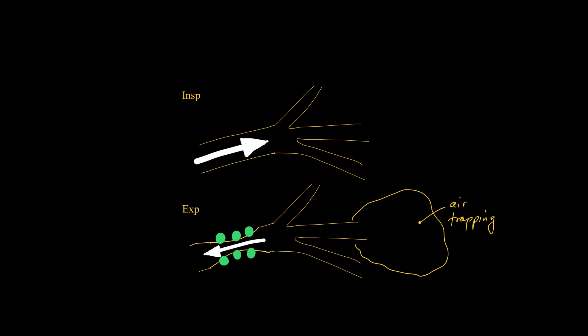This is an example of air trapping within a secondary pulmonary lobule. The centre of the lobule contains a central bronchus and a pulmonary artery. The pulmonary artery undergoes vasoconstriction because of the hypoxic environment created by air trapping. That is very common.